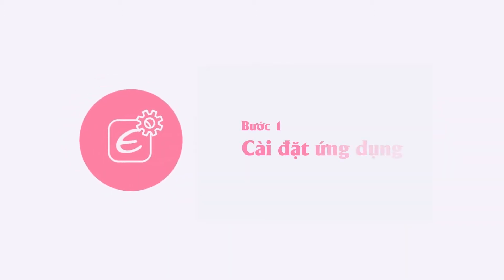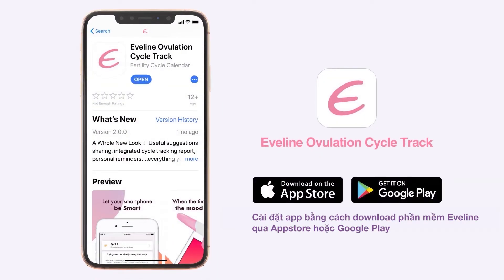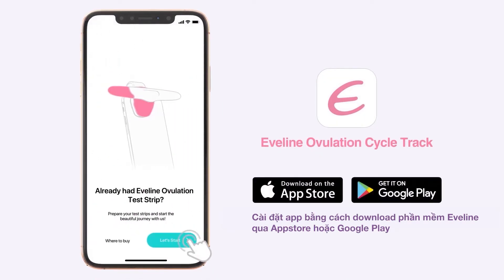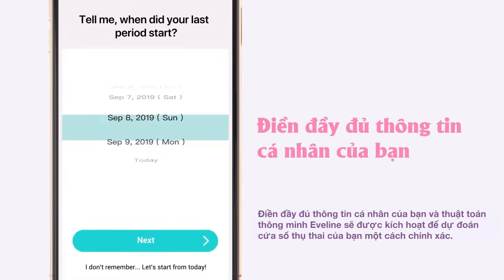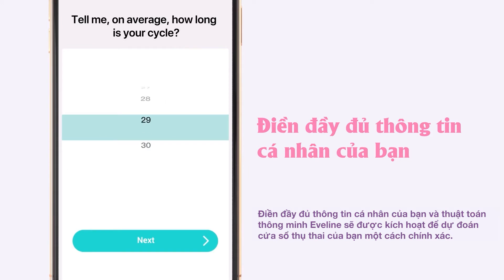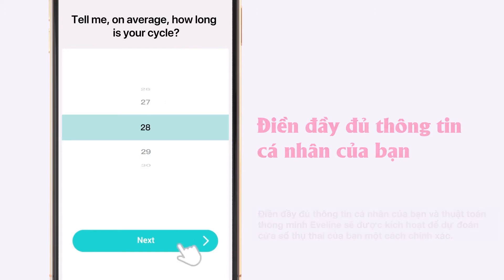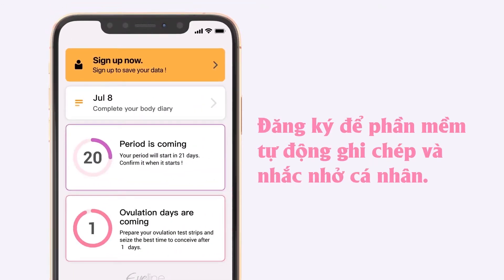First, set up the app. Download the EveLine app through the App Store or Google Play. Fill in your personal details to enable the EveLine smart algorithm to accurately predict your prime fertile window. Register and enjoy the automated recording and personal reminder function.